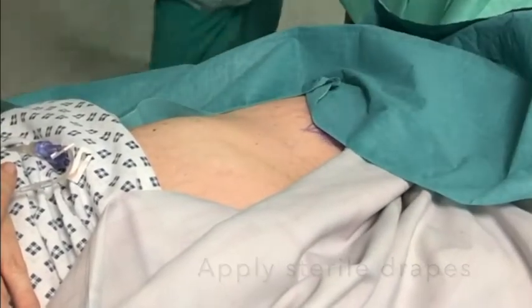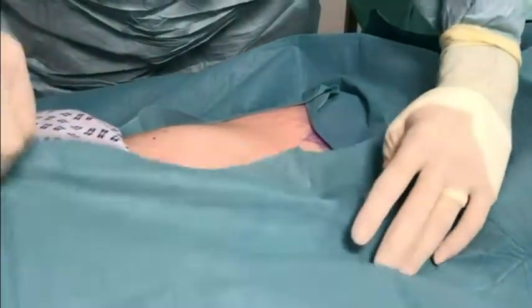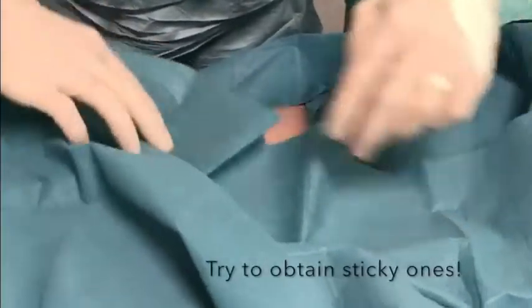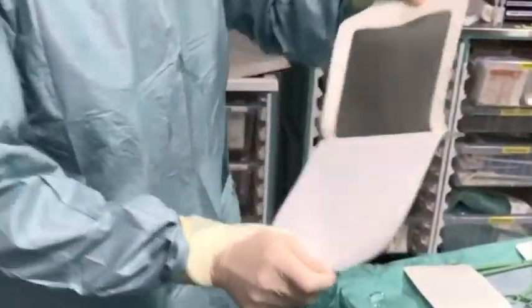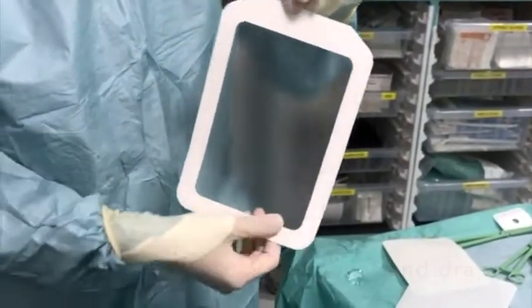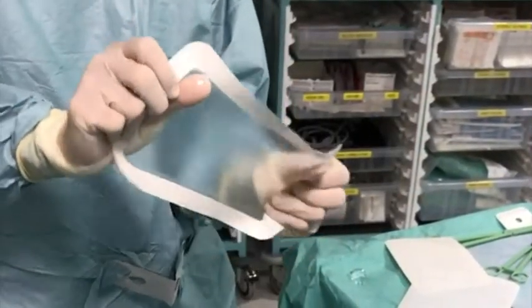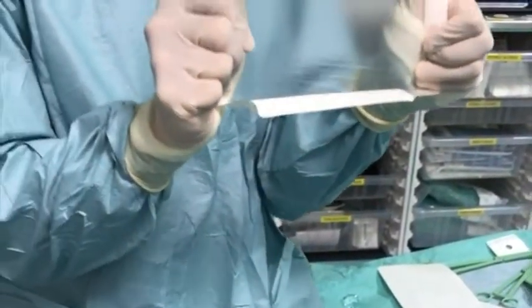Patients will not thank you for sticking drapes to their pubic hair, so protect this with a sterile gauze or a sterile towel if necessary. Your assistant will provide you with a 50mm ultrasound probe covered with some sterile jelly. Use a large tegaderm dressing to cover the probe head and provide sterility.